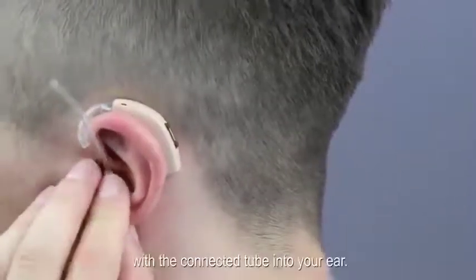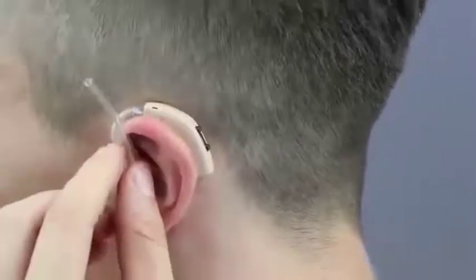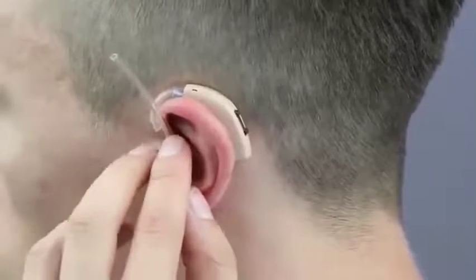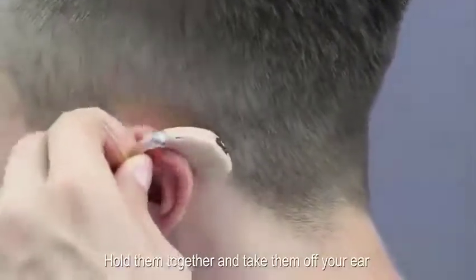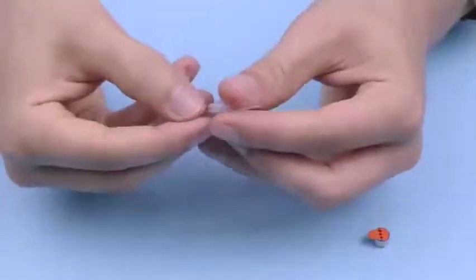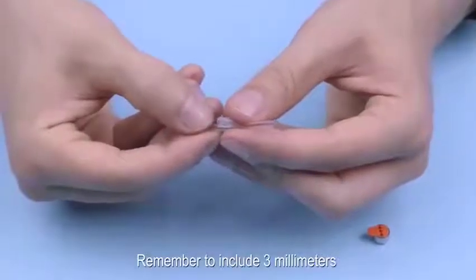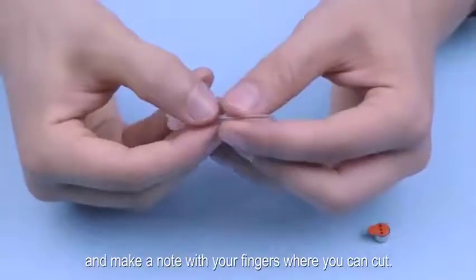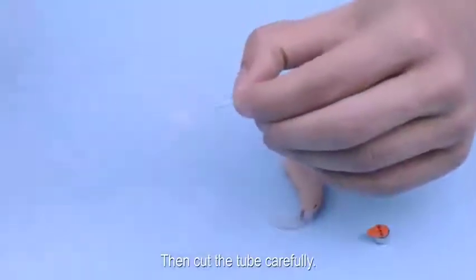Then insert the earplug with the connector tube into your ear. Hold them together and take them off your ear to see where you will need to cut the tube to fit your ear. Remember to include 3mm and make a note with your fingers where you can cut. Then cut the tube carefully.